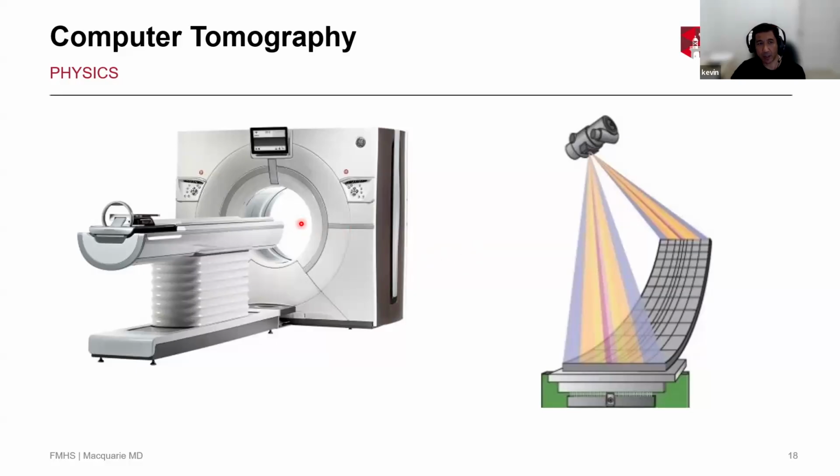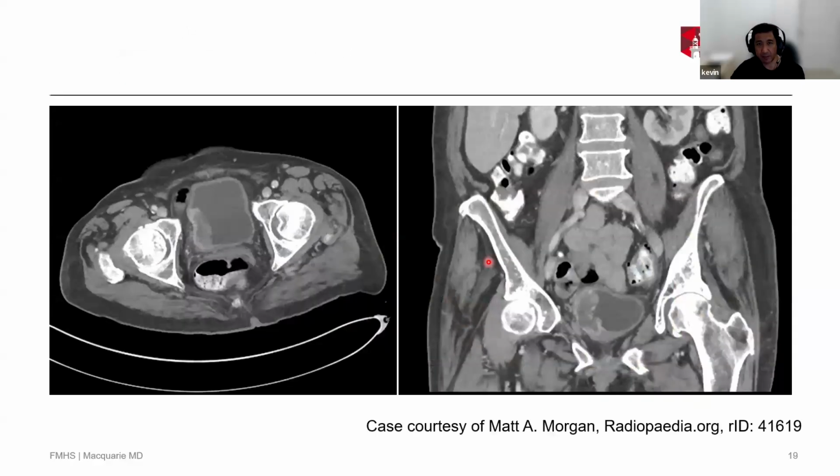And in fact, when we image the abdomen to the legs, the scan can actually be so fast, it actually outruns the contrast. So when we actually image the legs, we actually have to slow it down, which wasn't the problem in the olden days. In the olden days, we couldn't keep up, but the scanners now are so fast. But it results in amazing imaging.